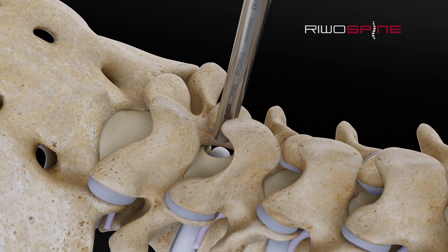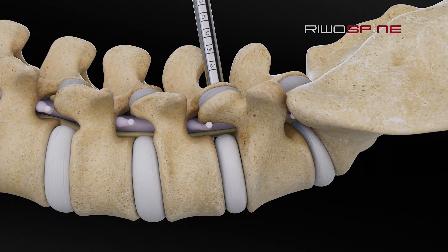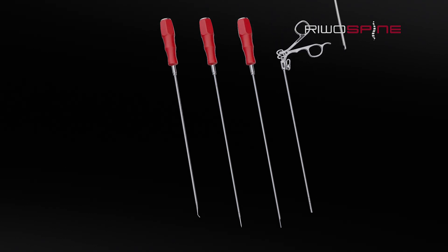With the specialized working sleeve, the surgeon can protect all neural structures while preparing the disc space. A variety of specific instruments are required for the removal of disc material and the precise and clear preparation of the disc space.